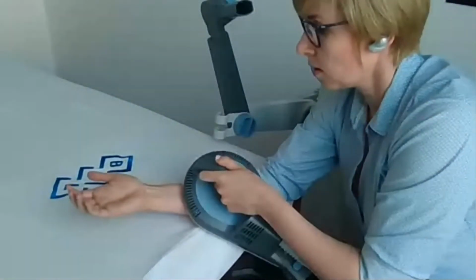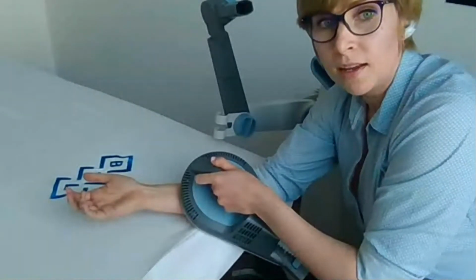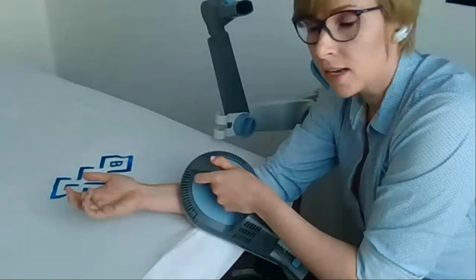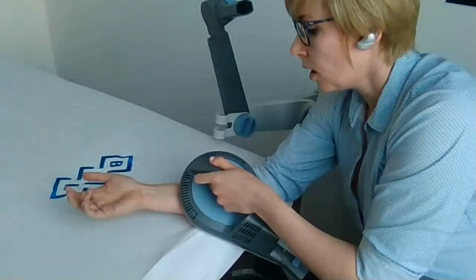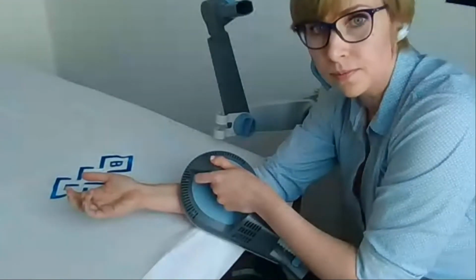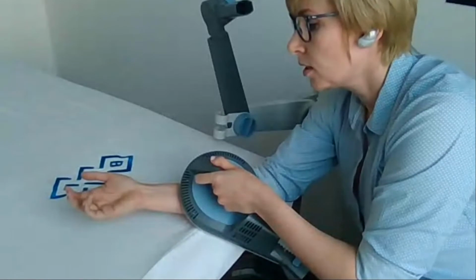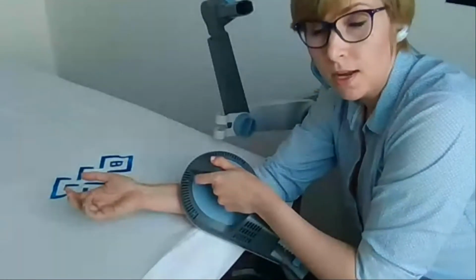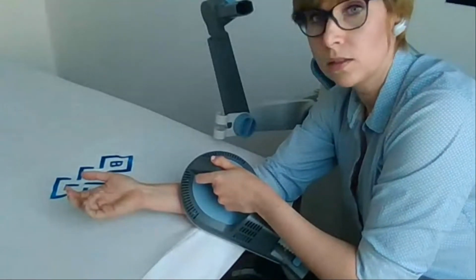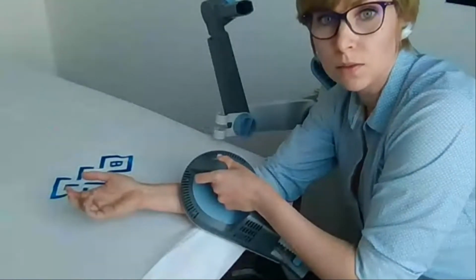And the point is to find the motor point. And in this case, I am working with the nerve. So I can decide, in this case, that I want to stimulate the nerve. If I want to stimulate the muscle, I should apply the applicator on the muscle belly.